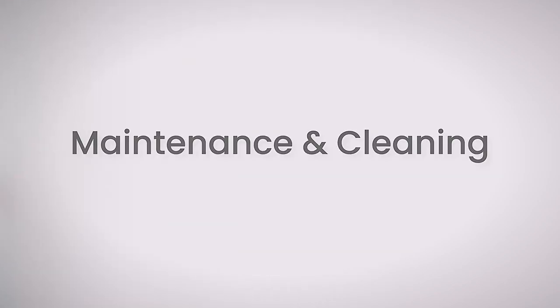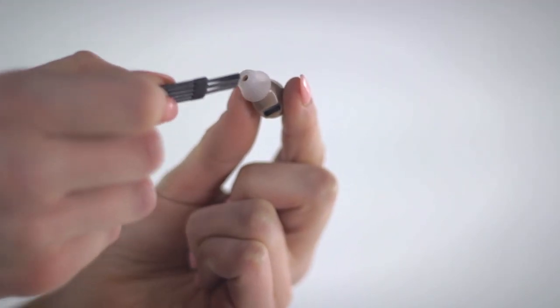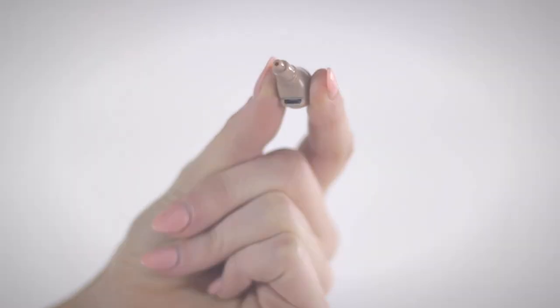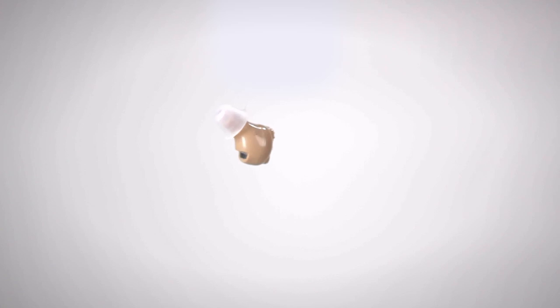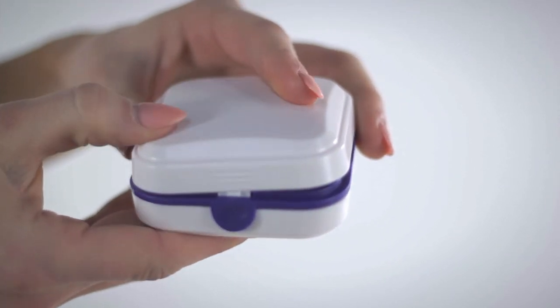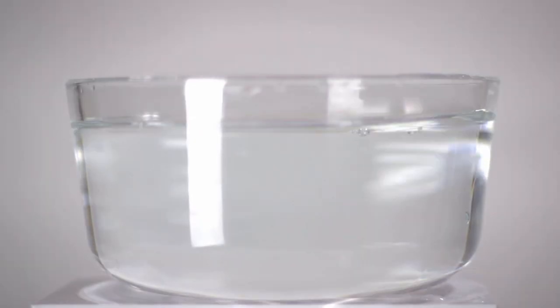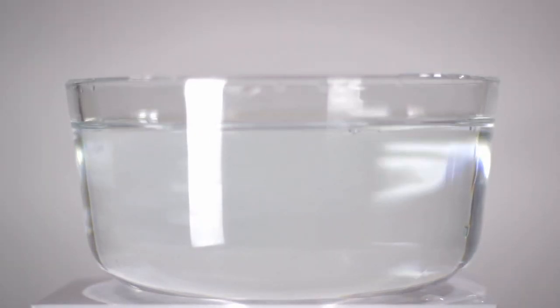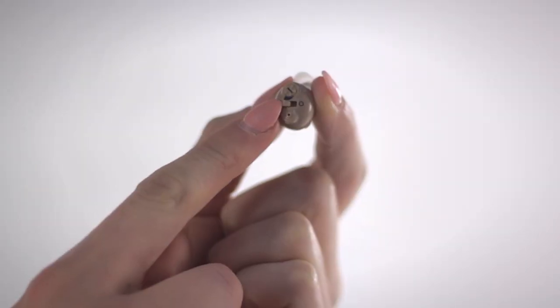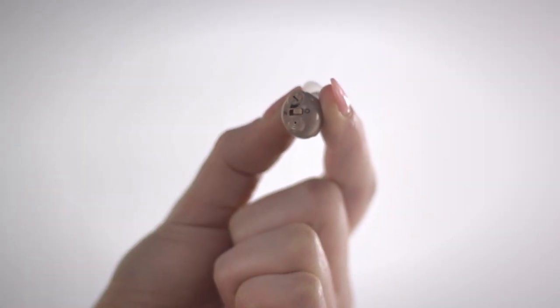Maintenance and cleaning. Clean the hearing device and the earplugs with a clean, dry cloth after each use. Allow the hearing device to dry completely after cleaning and store it in a safe, dry, and clean place. Do not submerge the hearing device underwater, as this can cause liquids to enter and damage the hearing device. And remember to turn off the hearing device when not in use.